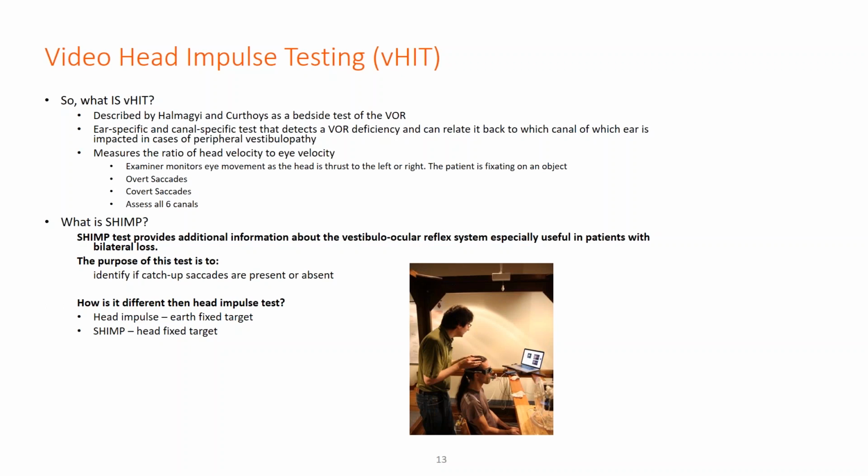And then here's a test of our device being validated against the scleral search coil. We are proud to say that we are still the only manufacturer on the market that has done that for all 6 semicircular canals.